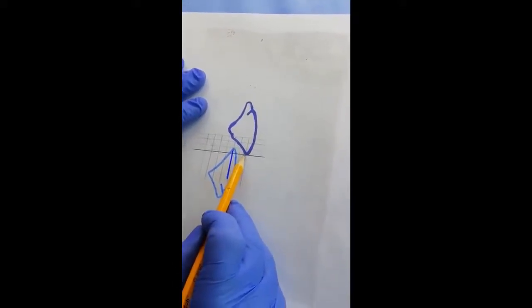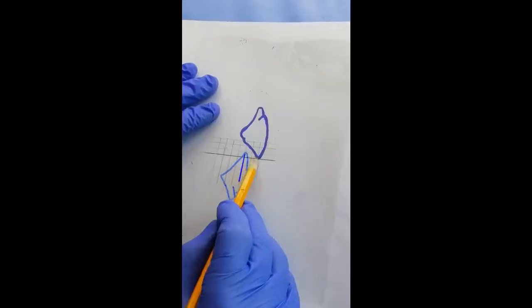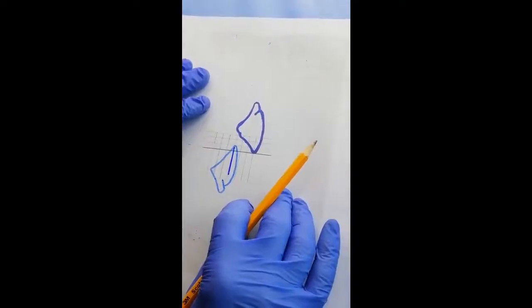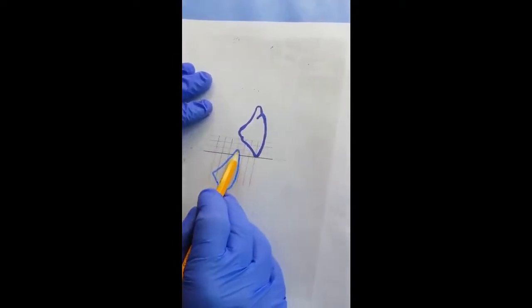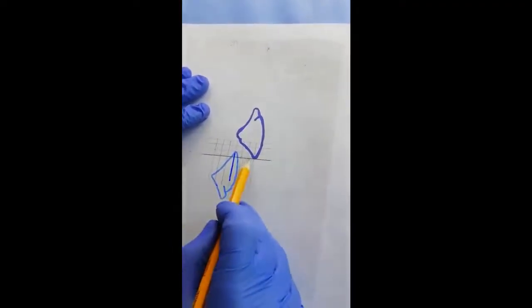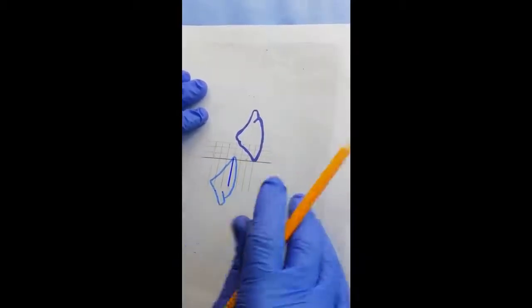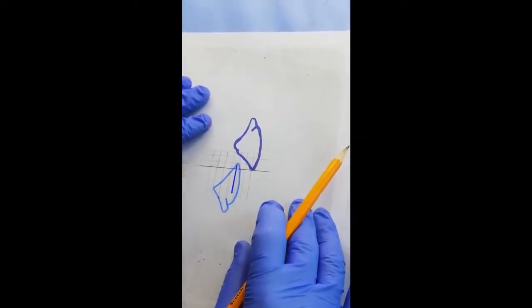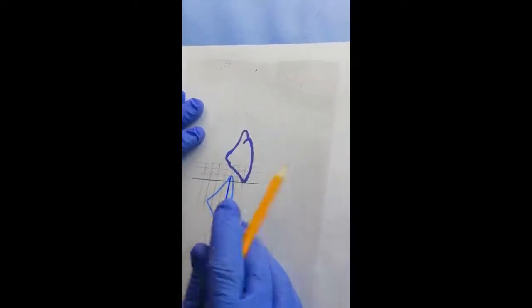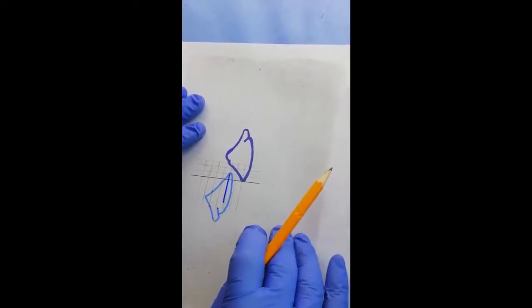Now, if we want to decrease the incisor guidance angle, we have two options: whether to increase the overjet, like this way we decreased the incisor guidance angle, so we can increase the overjet, or decrease the overbite. Okay, if we put it in the original position like this, we can reduce the incisor guidance angle by reducing the overbite or by increasing the overjet.